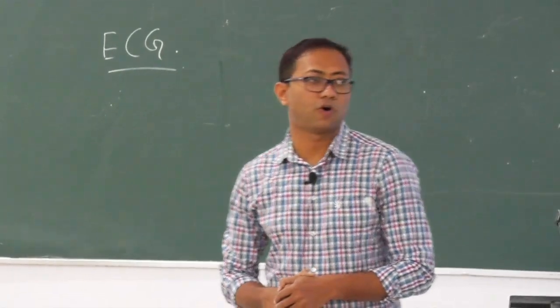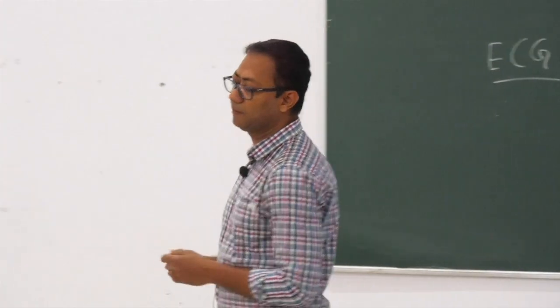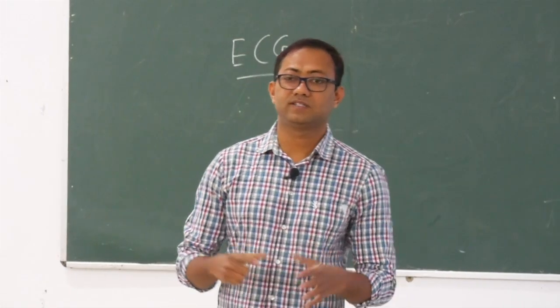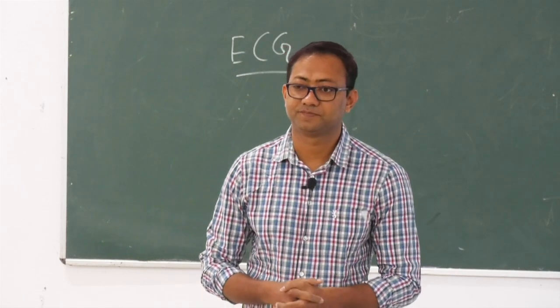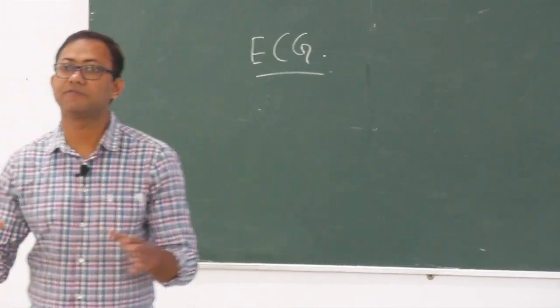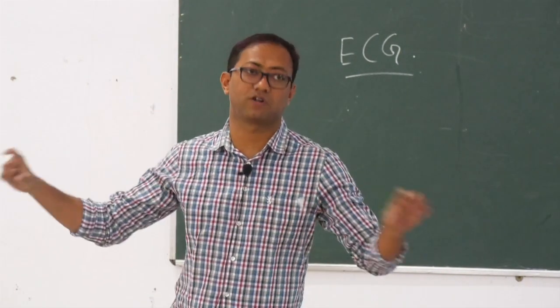Okay, ECG or electrocardiogram. So, the first question that appears is what is electrocardiogram and what is electrocardiograph, right? Anyone, any idea? What is electrocardiogram, and what is electrocardiograph? Yes, graph is the machine, and gram is the paper strip, the record, right?